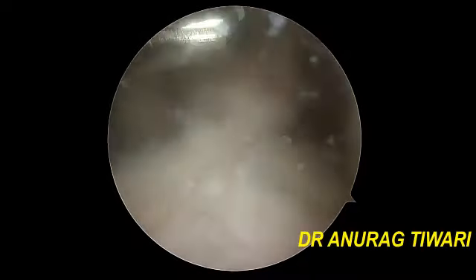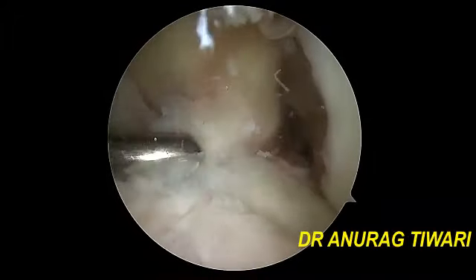And now we are moving on to the notch area. So this is the notch area. This white structure is the ACL that has been detached from the femoral insertion and is lying just close to the PCL. This is the PCL. These fibers are of the PCL which are originating from the medial femoral condyle and going posteriorly and getting inserted onto the posterior surface of the tibia.